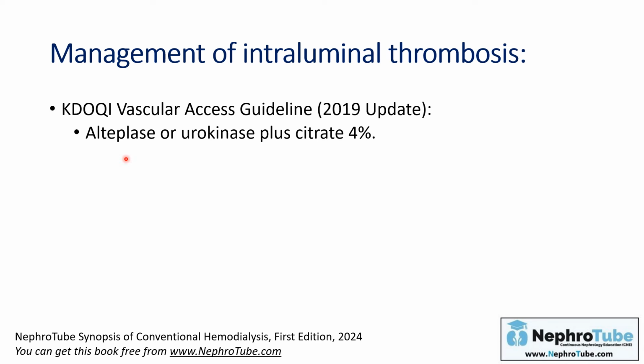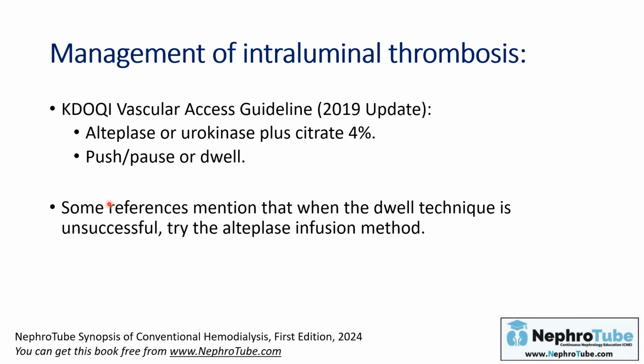And I will talk about the recommended dose for alteplase now. Also, they recommended the use of the push-pause or dwell method techniques. So you have to put the alteplase in the catheter by the push-pause method or dwell method, and I will discuss both of them now in detail. Some references mention that if the dwell method failed, and for sure if the push-pause method failed, if both of them failed, you can use the infusion method.